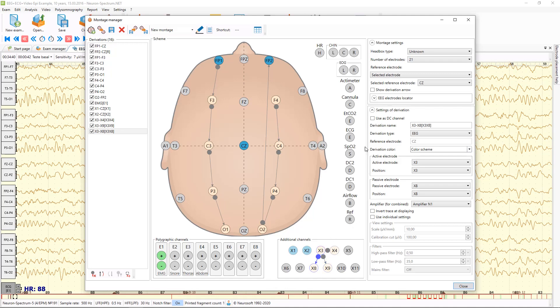And you can use non-EEG channels from this list, such as air flow, thermistor sensor, DC channels, SpO2, separate ECG channel, CO2 channel, cannula, actimeter, EOG, and chin and heart rate channels.